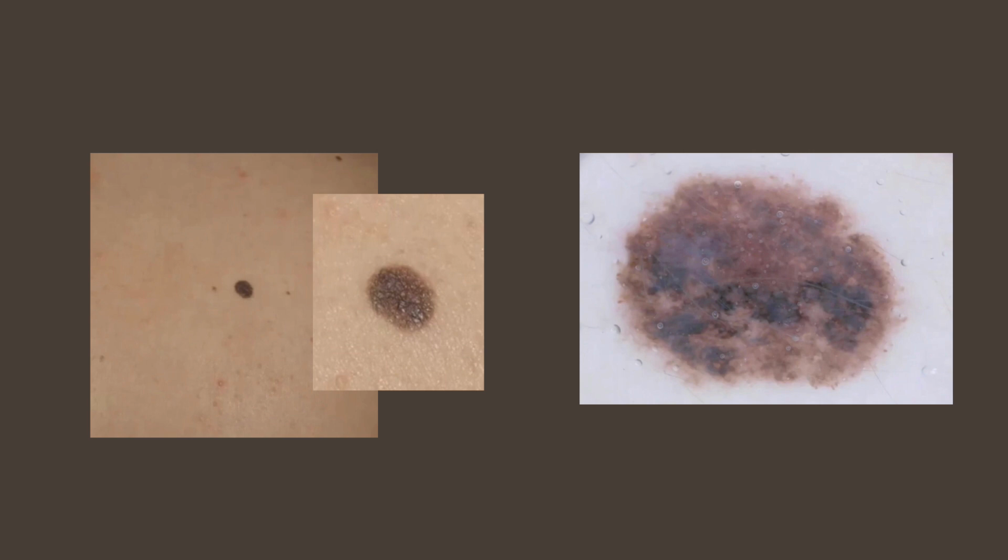Look at this lesion. Does this look sinister to you? Another close-up view of the same nevus. If you apply the traditional ABCD criteria of melanoma on this lesion, this looks fairly symmetric. There is no border irregularity and there is no color variation as such. But on dermoscopy examination, this was actually a melanoma.